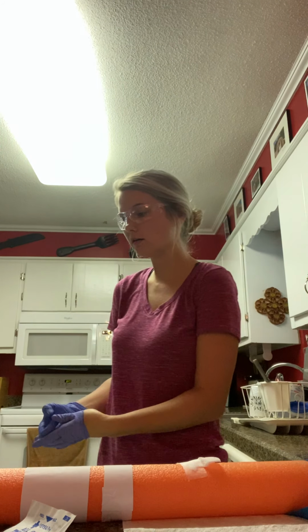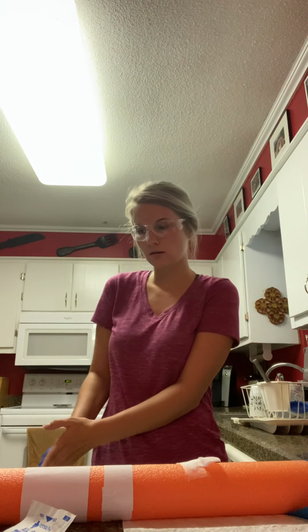You would remove your gloves, perform hand hygiene, lower the patient's bed, and make sure the patient was in a comfortable position, make sure the call light was in reach, and then you would go back to the nurse's station and you would document.